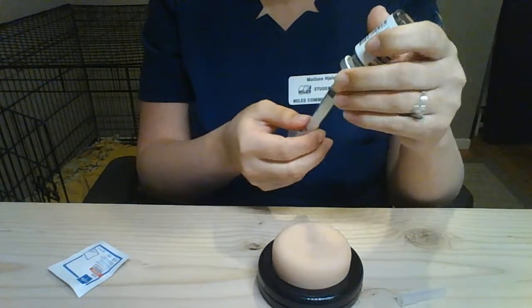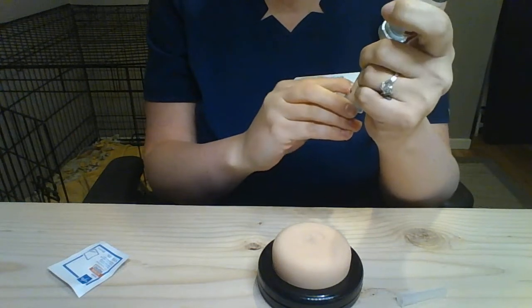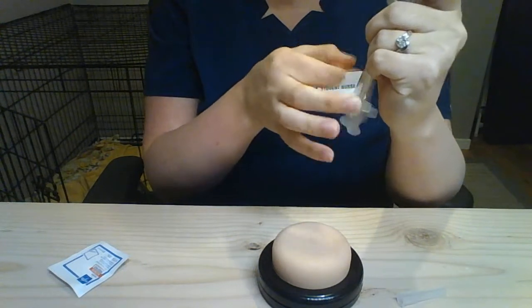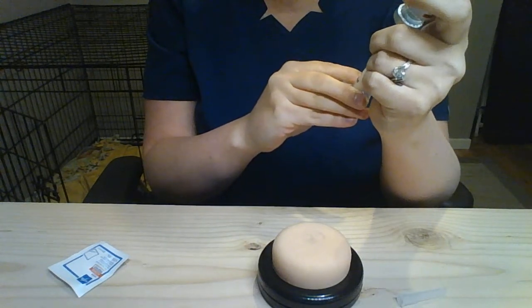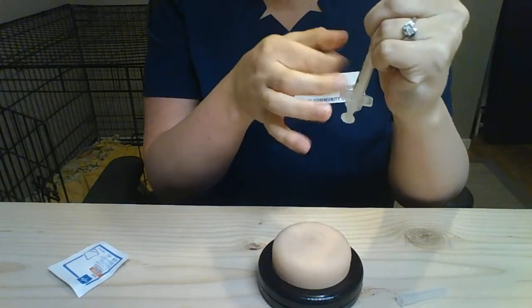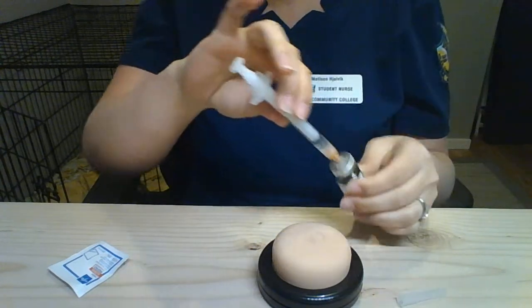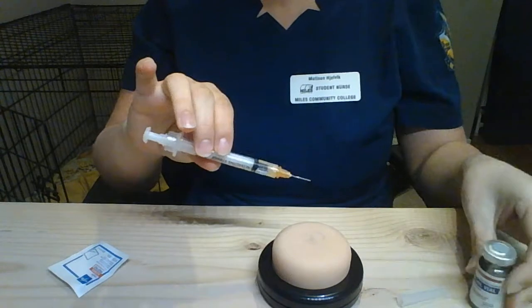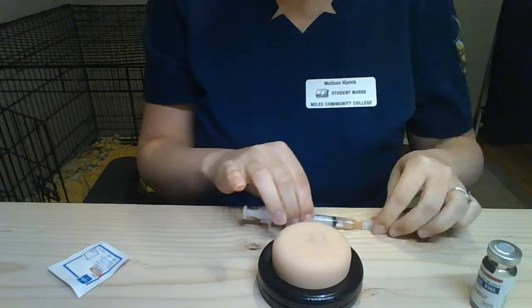And then at a 90 degree I can tip this up and pull back and tap to get rid of any air bubbles. Make sure it's at 0.5. Okay. Got rid of all the air bubbles. Remove the needle and do the one-handed recapping. Swooping. So I got my medication ready.